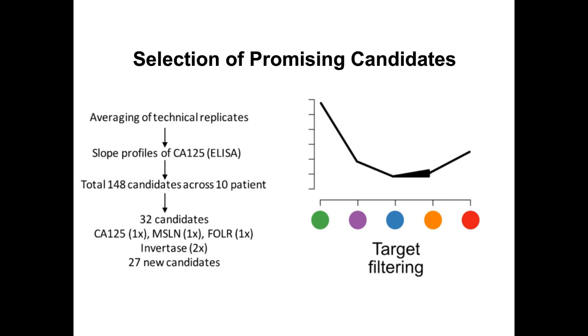If one looks at CA125 ELISA data, what's very obvious is that CA125 is highest at diagnosis, lowest at the end of chemotherapy. CA125 then actually stays kind of flat. And this is probably where the relatively poor sensitivity of it comes into play. So we asked the question, do we have any peptides that rise already in this stage?